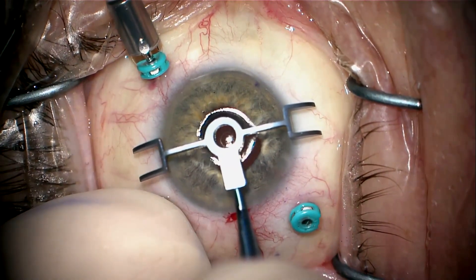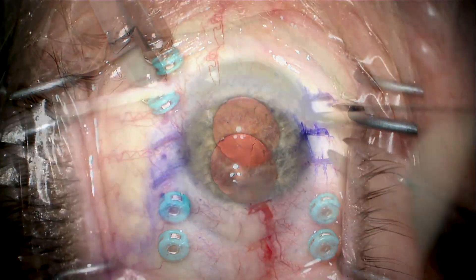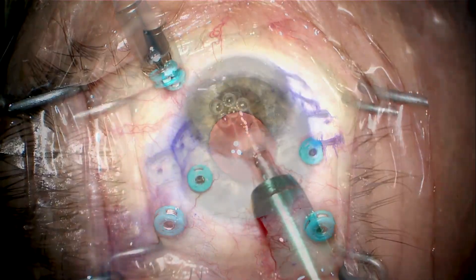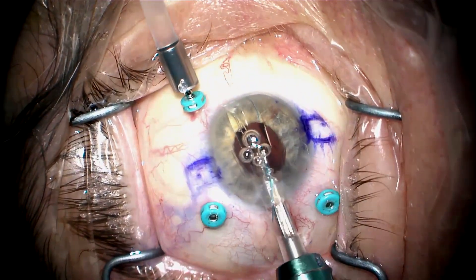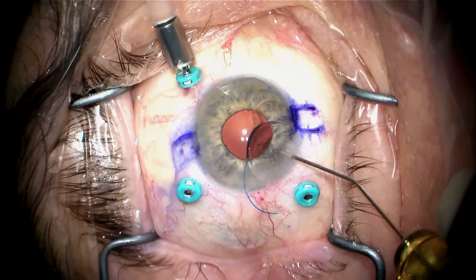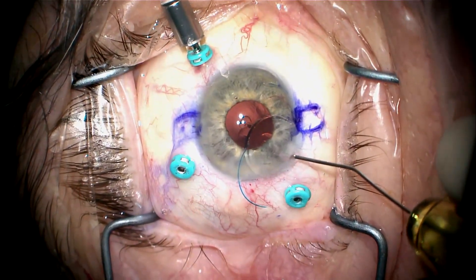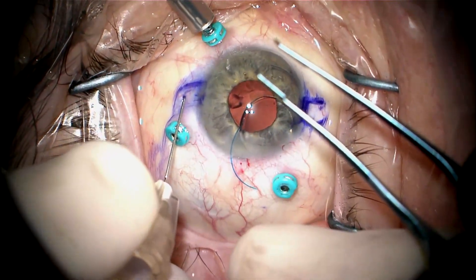We're now going to mark the eye so that I can do Yamani intrascleral haptic fixation. These marks are placed about 2.3 millimeters posterior to the limbus. The lens is injected, and I shut the infusion off and place a little viscoelastic on top of the lens to protect the cornea and to prevent egress of fluid out the main incision.